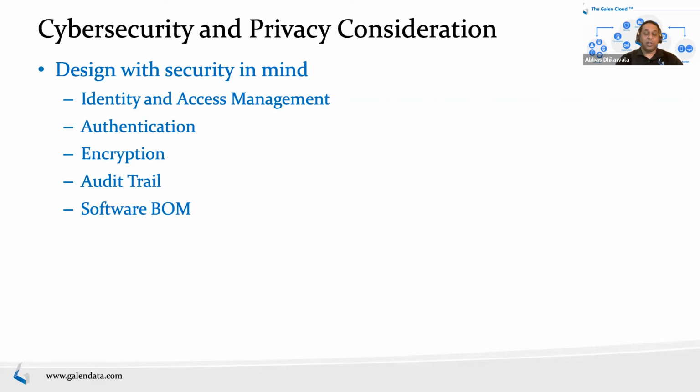You may not be using the features within the library that have the vulnerability, or you may be using it in a way that the vulnerability is not exposed further down, or there may be actual vulnerabilities. You want to do the analysis. You want to keep that as part of your ongoing surveillance, but also during design. There are several free or paid tools that allow you to create a software bill of materials and then track well-known vulnerabilities from the CVE databases, assuming these are open source libraries. And this includes other things in your operating system, if you're using one, and any other software that's not yours.